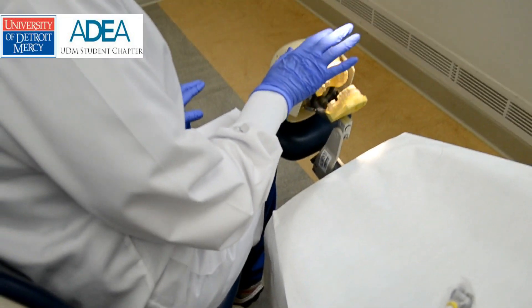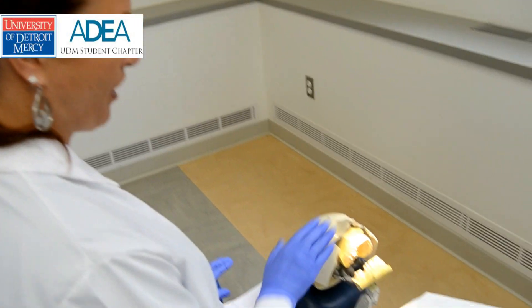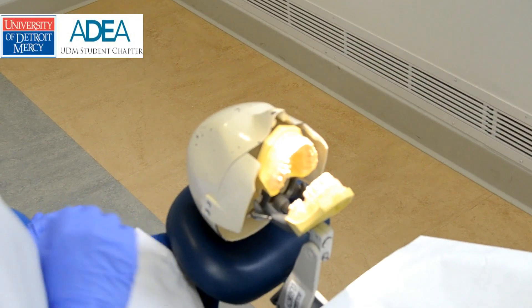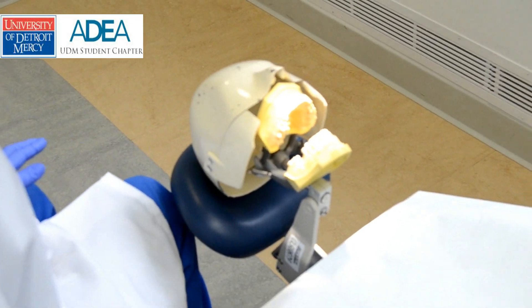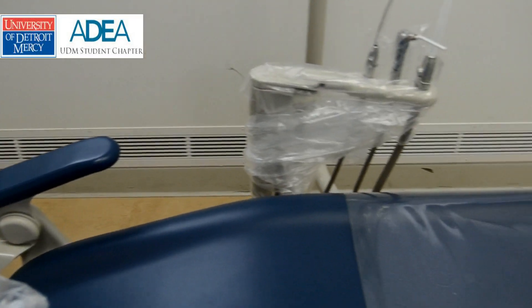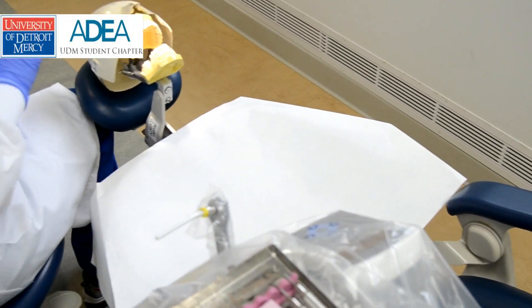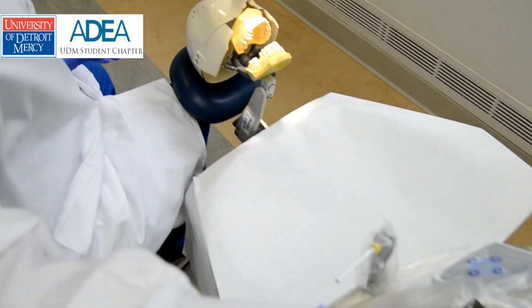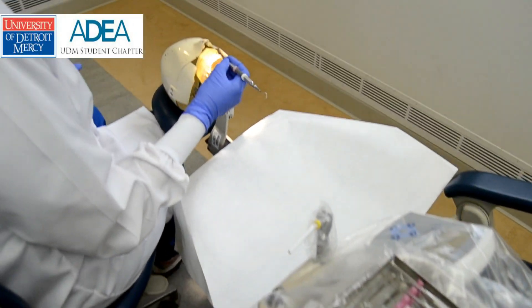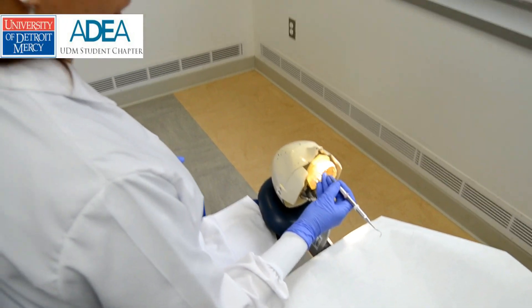There are some other rules: the nose and toes are equal — when the patient lays back in supine position, their nose and toes line up. Also, our chair bumps into their chair. The headrest is back because we're going to be instrumenting the maxillary. I'll do my modified pen grasp.